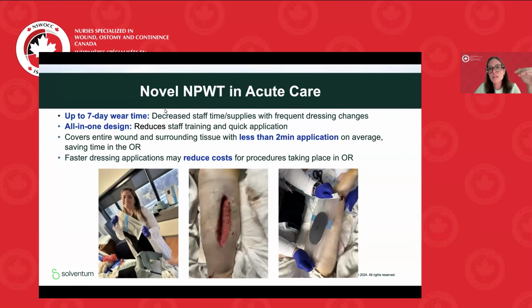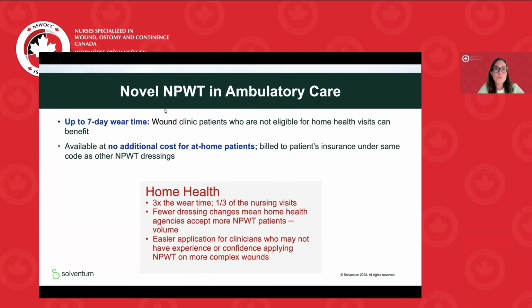She did it well. So I'm also thinking that the more that we use this, we're going to see a little bit more standardization in how this is applied, and in the right wound, in the right patient at the right time. Potentially, we're not having the issue with leaving foam behind, or I don't know if you've seen a lot of times, instead of filling the wound, we're really stuffing the wound with the traditional negative pressure. So I think as we learn about this dressing, we're going to see some of those issues mitigated as well.